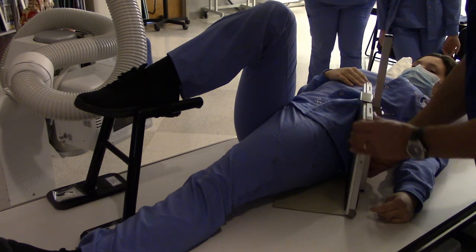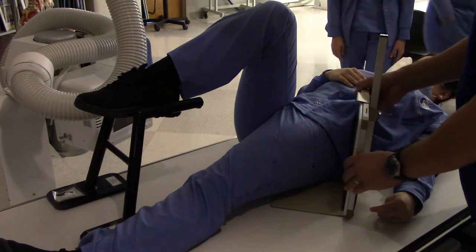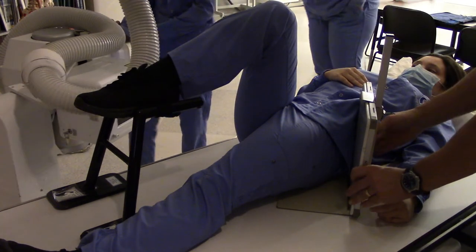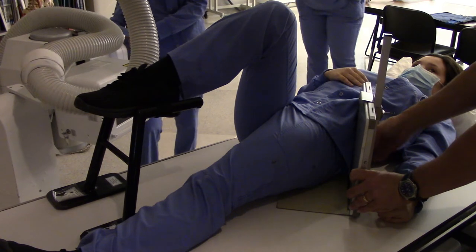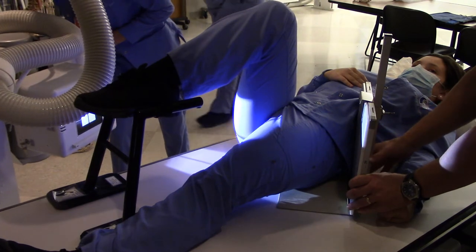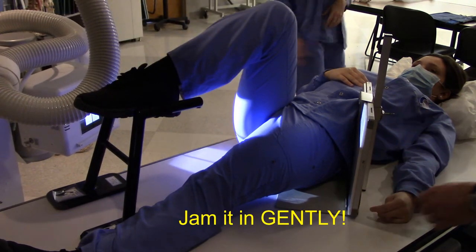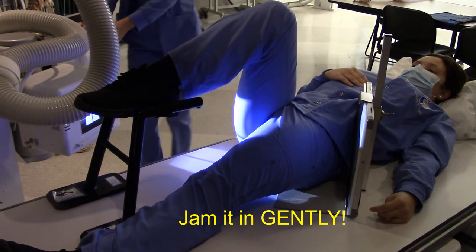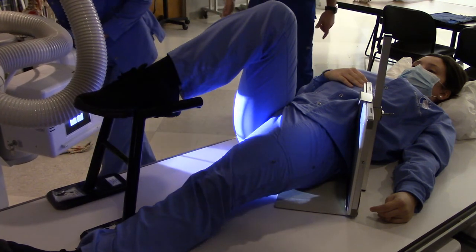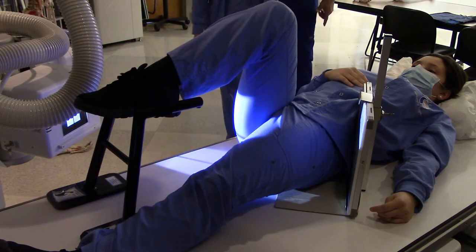What we're going to do is just eyeball the floor — we've got these lines here that we can line up with, so right about there. I've got this positioned below the patient's ribs but above their crest, so I've got soft tissue to work with. I'm just going to jam this into my patient — there we go. Now Miss Hope, aim for the center of that image receptor, get a good angulation, and reduce your SID as much as you can.